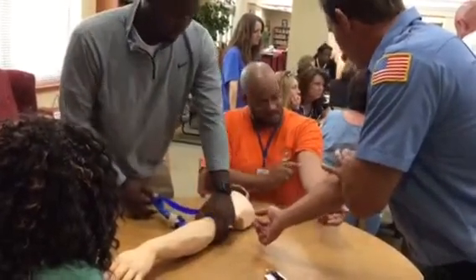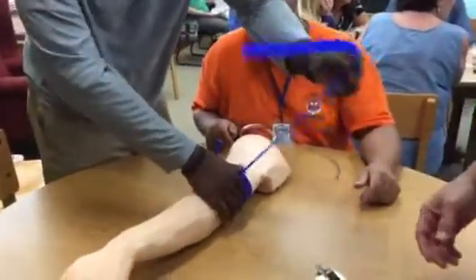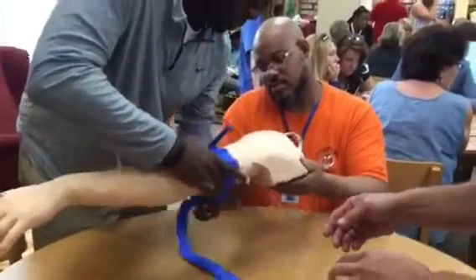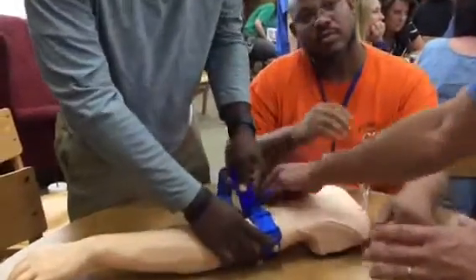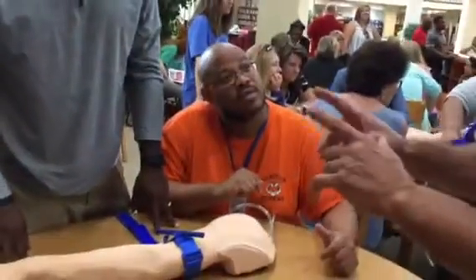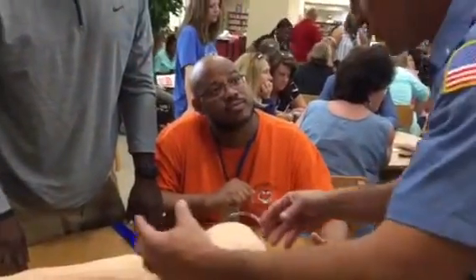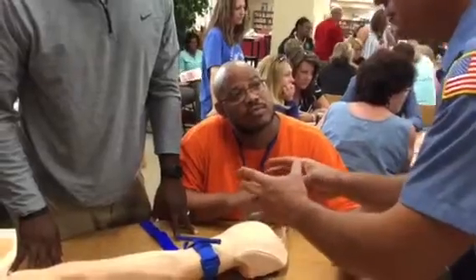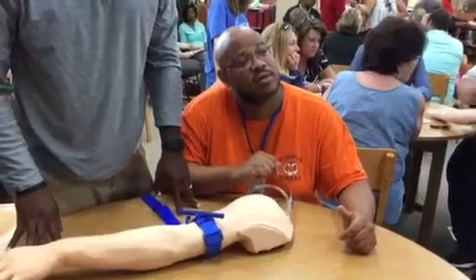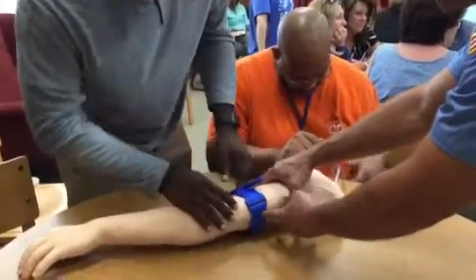You're going to get to the end of the muscle. You can pull that on just the back of the muscle, pull it all the way around just how you can get it. Now, the thing about it is you don't have to come through there yet. This is a stressful situation. The number one thing to do is take a deep breath before you start and put this thing on. If you can just slide it on the arm, that's easy. If you go around a leg or something, you'll have to undo it and feed it around the leg, and back through the loop.